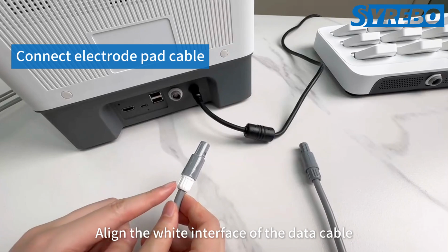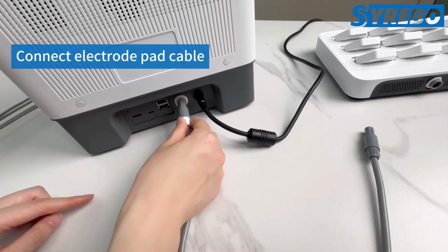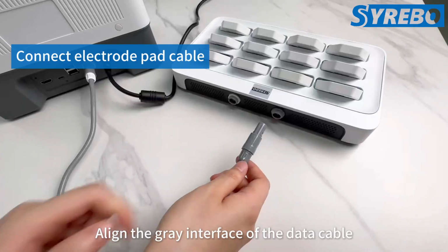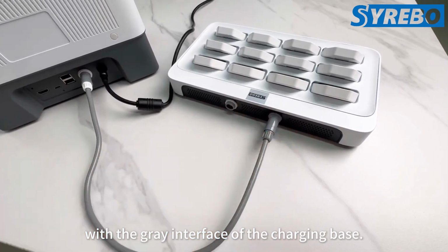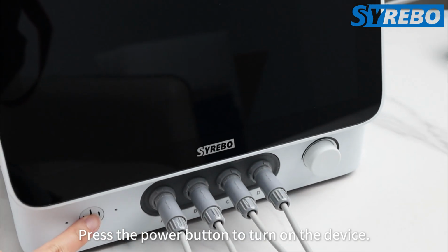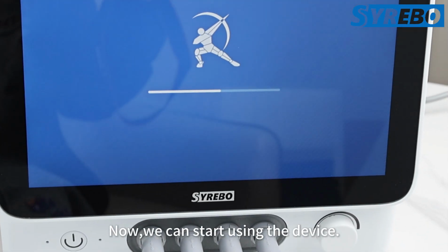Align the white interface of the data cable with the white interface of the main unit. Align the gray interface of the data cable with the gray interface of the charging base. Press the power button to turn on the device. Now, we can start using the device.